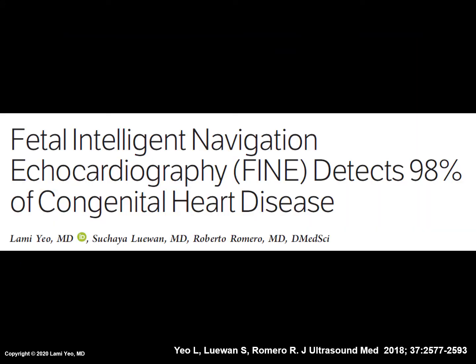A final comment about the relationship between STICLoop criteria and the success of FINE. The article shown here was a study conducted by our team to determine the sensitivity of FINE in the prenatal detection of congenital heart disease in 50 fetuses in the 2nd and 3rd trimesters. As the title states, the detection rate was 98%.